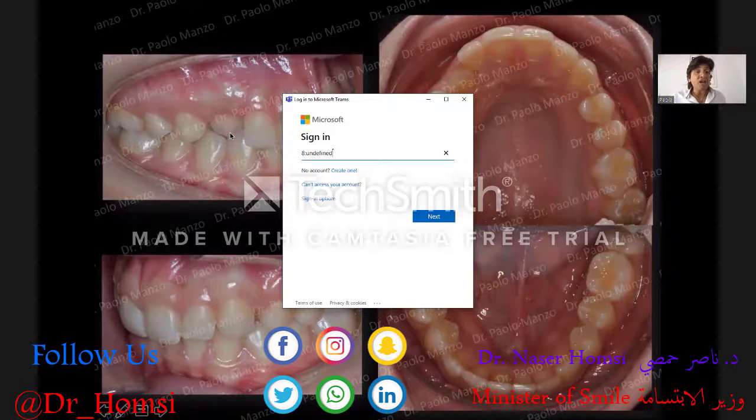Okay, but Sabrina has a class one on the left, class one on the right, very small spaces in the upper arch. And I can tell you, when I was speaking with Sabrina and I told her, Sabrina, I'm going to bond you a full appliance, okay? She was not very happy.